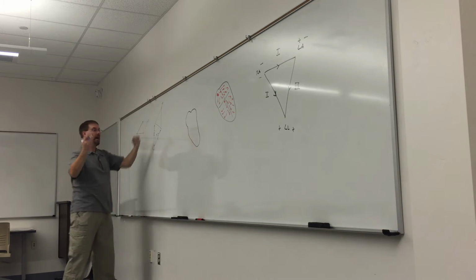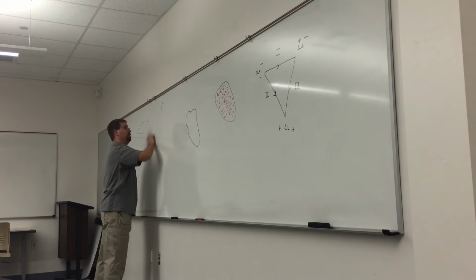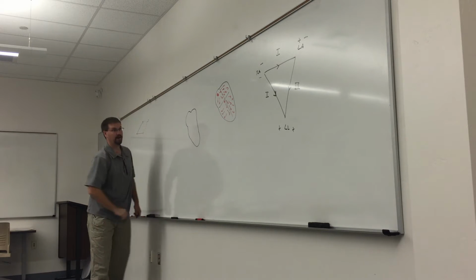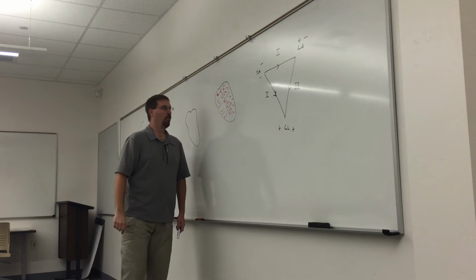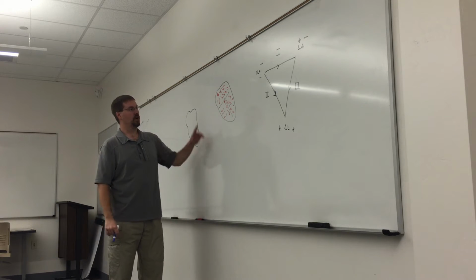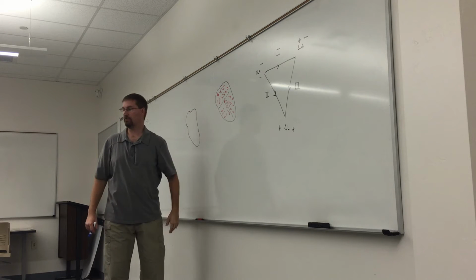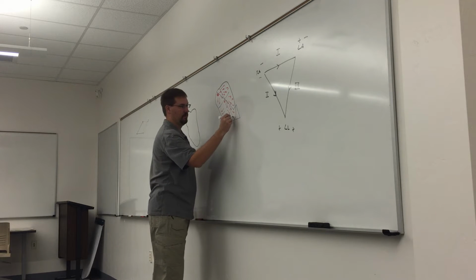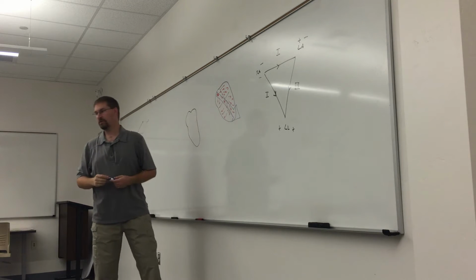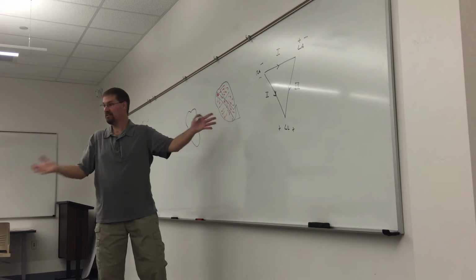Does that make sense? That's pretty much what we do with the heart. We add up all the little vectors, and we get an average vector. And if you had to guess, if I were to draw an arrow to represent the average direction of that depolarization, what would it be? Like this? Yes. Totally right. Okay, is everybody cool with that?